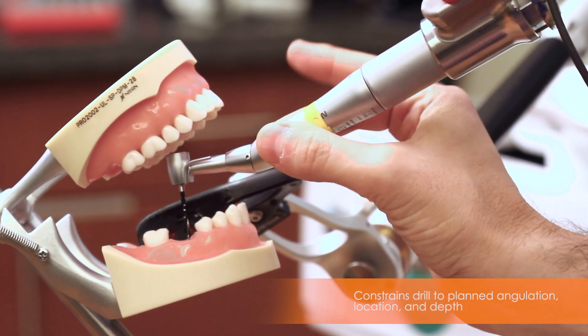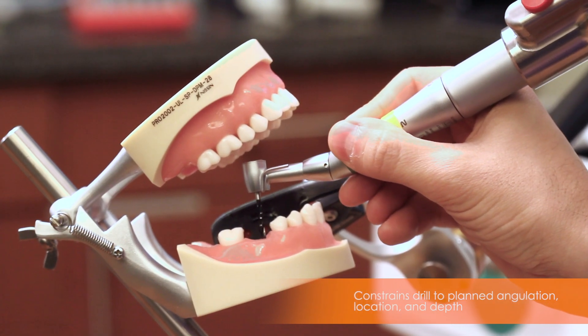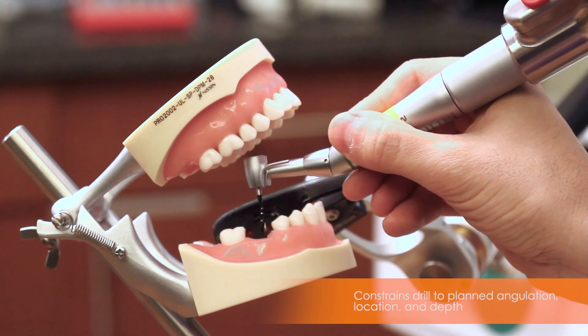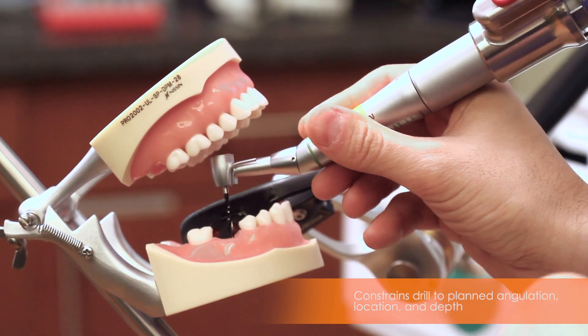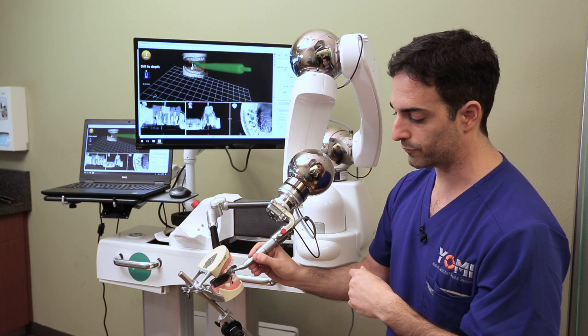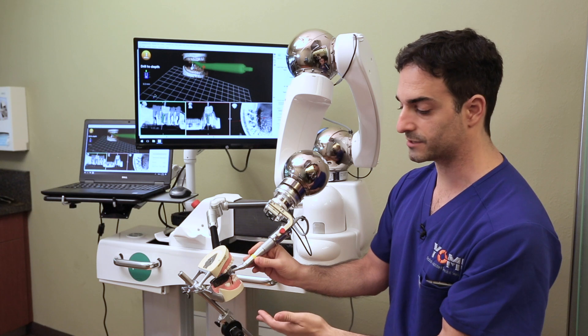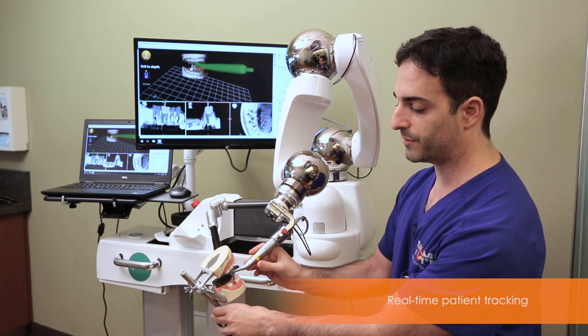Now I've got the right angle and the right position, and I can only drill in and out of the osteotomy — I can't deviate from that position or angle. I drill down to complete the osteotomy and back out. If I let go, the system will only rotate about the axis but won't ever change position or angle — it sticks with the planned trajectory.